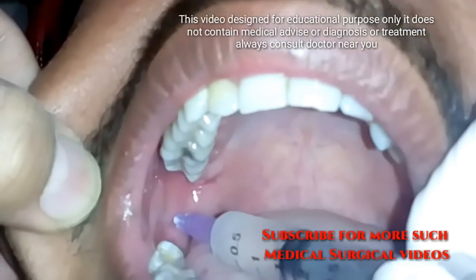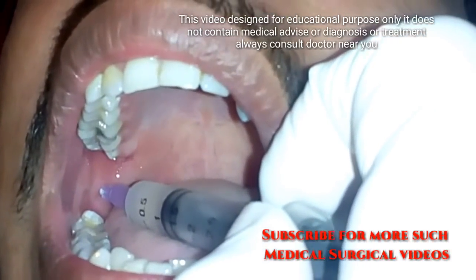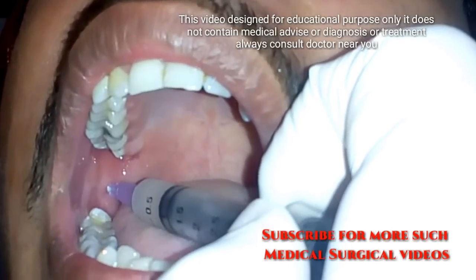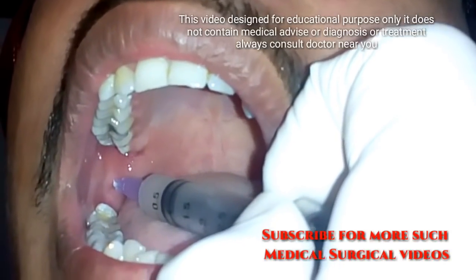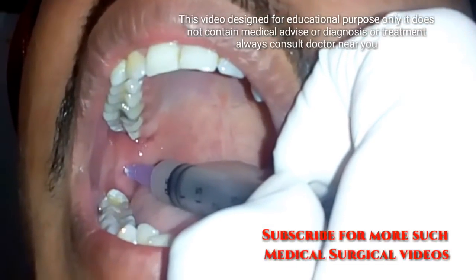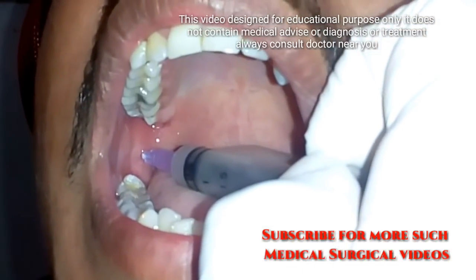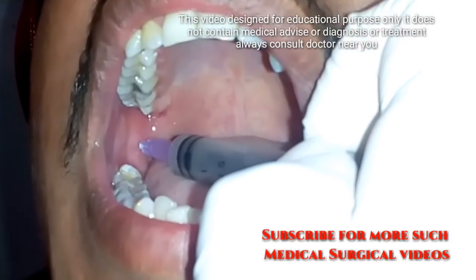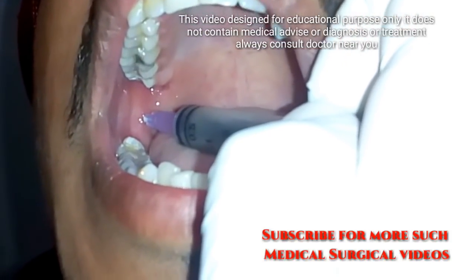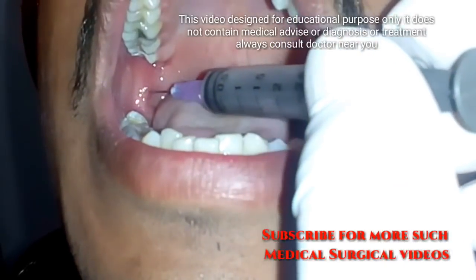The needle contacts the medial surface of the alveolar bone, while being lateral to the pterygomandibular fold and the sphenomandibular ligament. The injection is given very slowly.